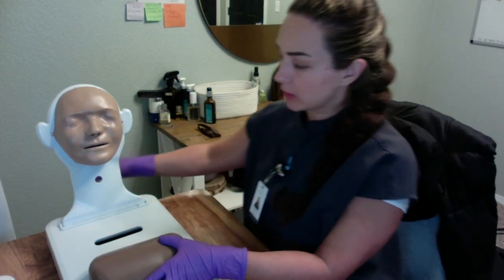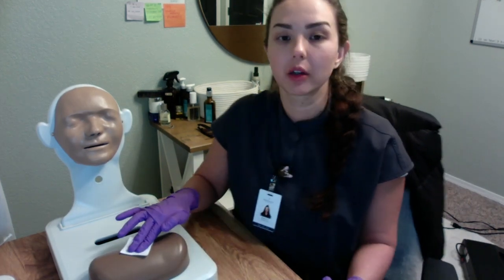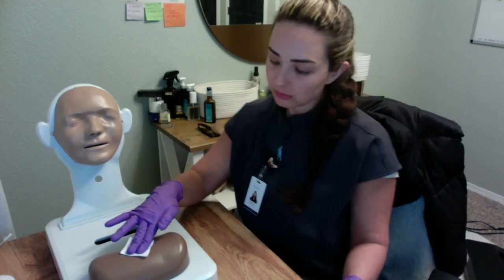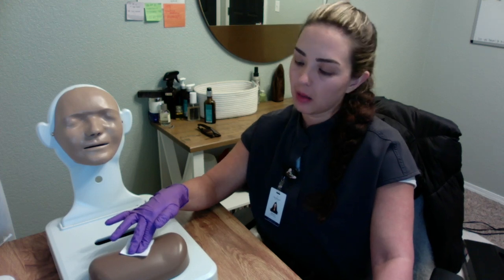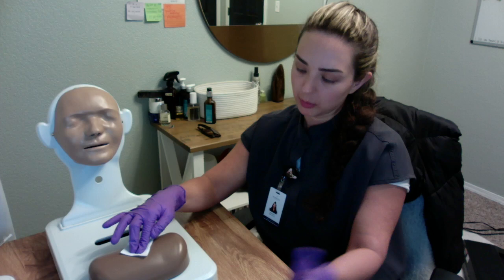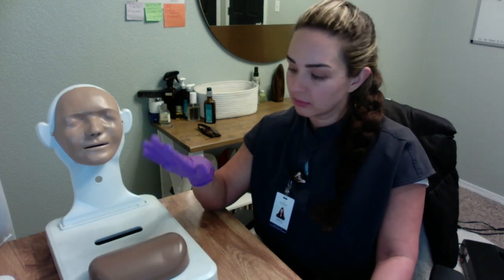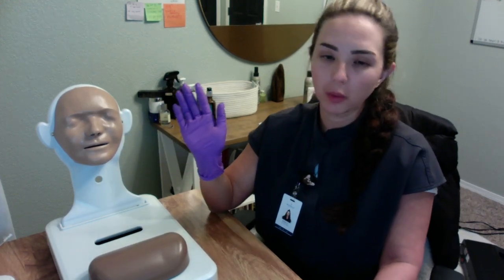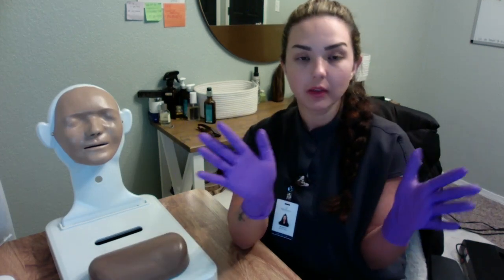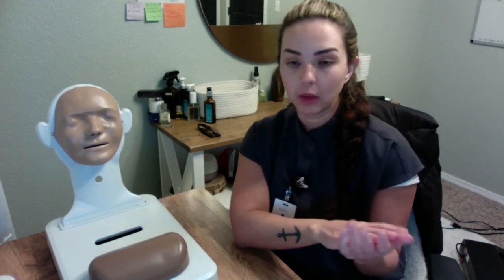So I'm going to go ahead and dispose of this immediately. And then I'm going to go ahead and place the gauze over the top gently. Again, we're never going to massage it or push on it aggressively. And then we will hold it for a second here. And then once we are okay with removing this, we would check for any bleeding and see if there was any Band-Aid necessary, which in this case there's not. So what we'll do from here is we will go ahead and remove our gloves, perform our hand hygiene, make sure our patient is okay, and then we would document the procedure.